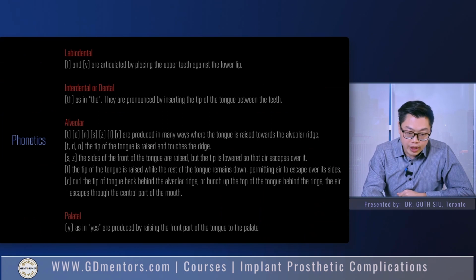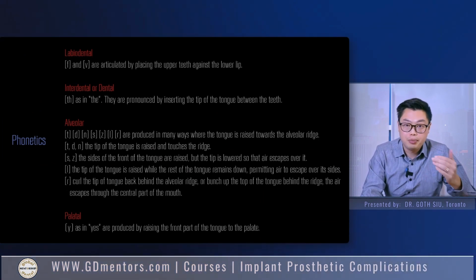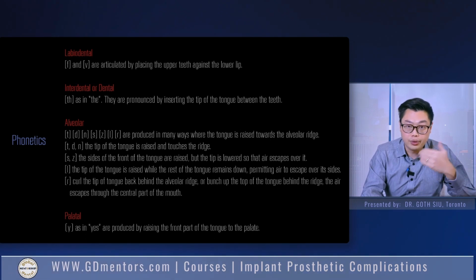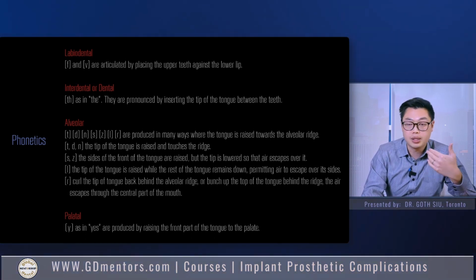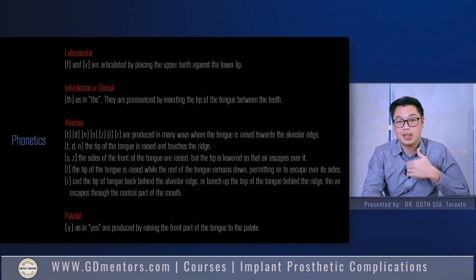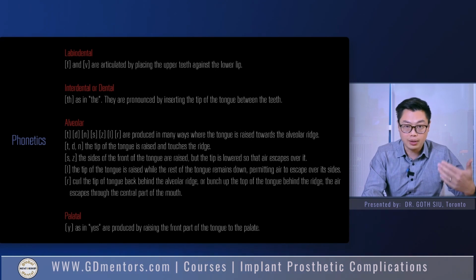Phonetics is a major issue. Certain words are based upon where the patient positions their teeth relative to their lip. Some phonetic words are based on the position of the patient's tongue relative to the teeth, or tongue relative to the soft tissue or the palatal area.